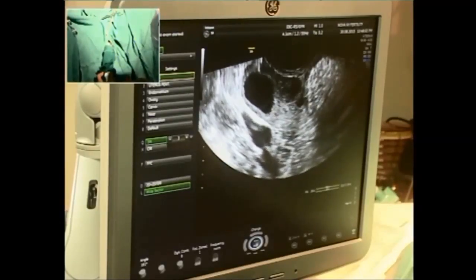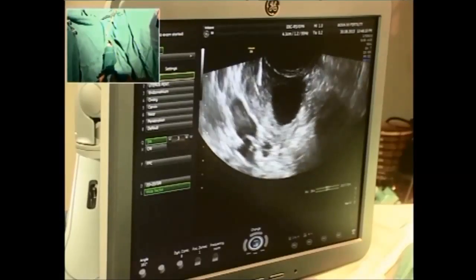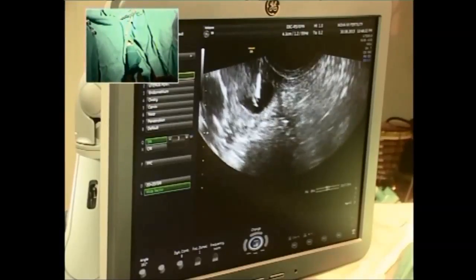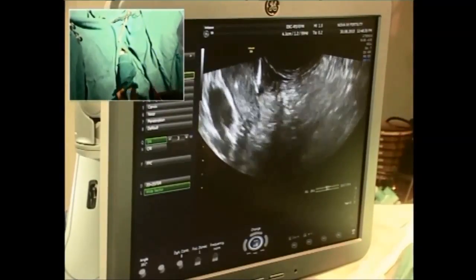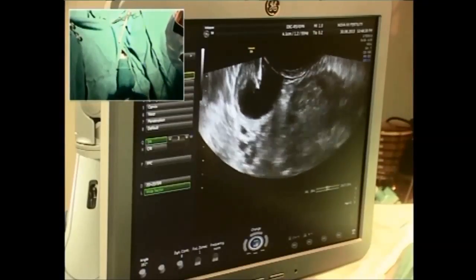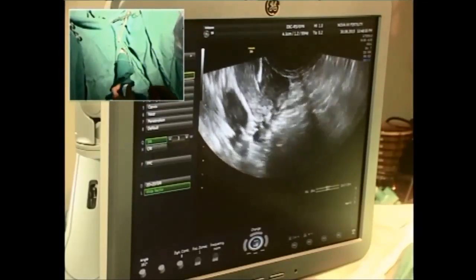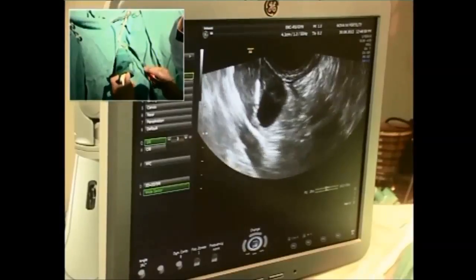As you see, I'm just slightly pulling the needle until the follicle is completely drained, then changing direction and puncturing the other one — the tube needs to be changed. Then I do a move up and down to be sure the entire follicle is drained, since in a single plane it may appear drained but actually isn't. Once sure the follicle is emptied, I rotate and confirm it's empty, then move the probe to identify the next follicle. It's very good to have the echogenic tip to be sure where you are — with current needles it makes life very easy.